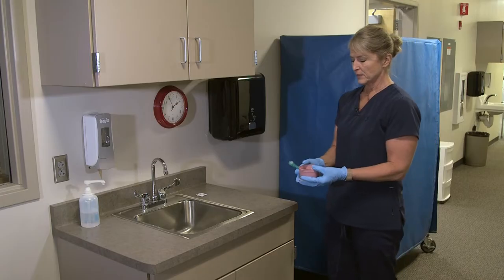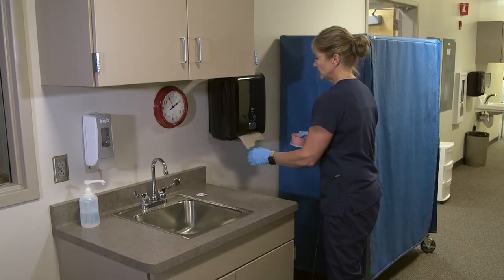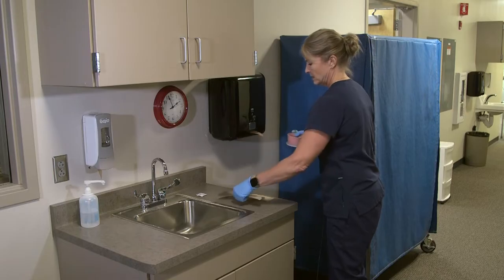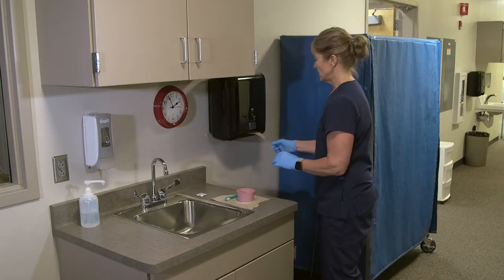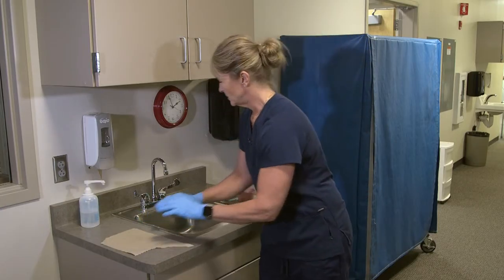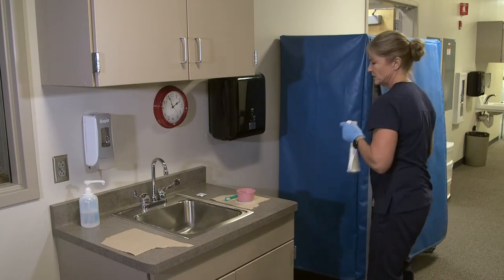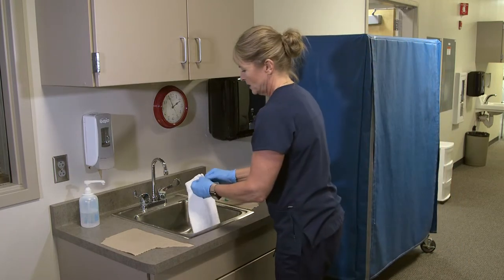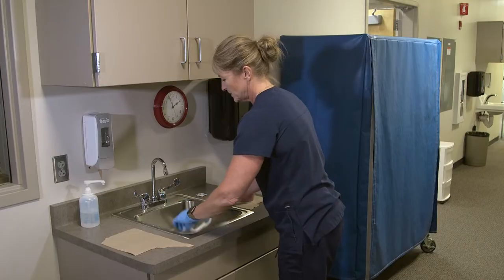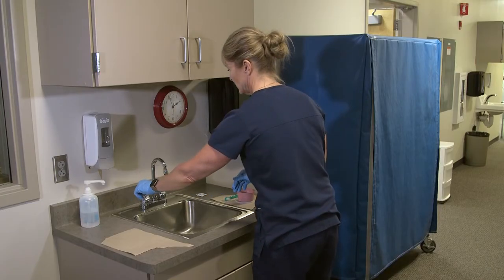So I would bring the denture cup and the denture brush over to the sink. I'm going to put down some barriers so that I have a place to put that, and it's not just on the countertop that may have some pathogens on it. I also need to put a barrier in the sink, which would just be a washcloth, so again if I drop the dentures they're going to land on the washcloth and hopefully not get damaged.